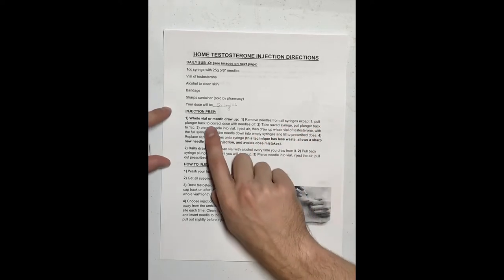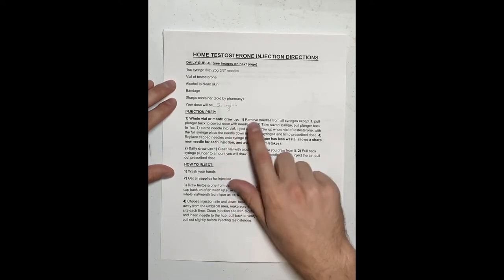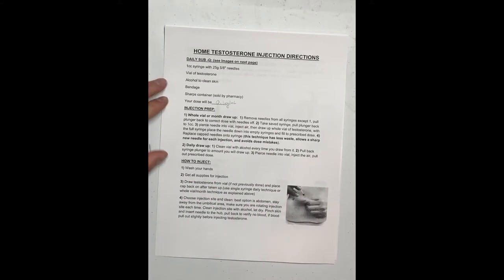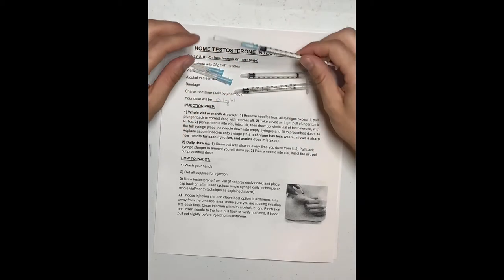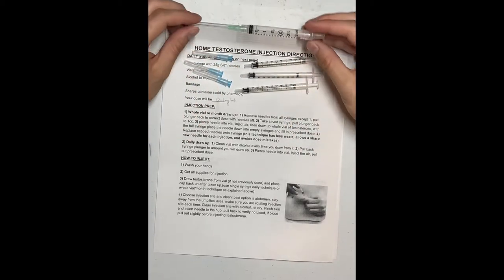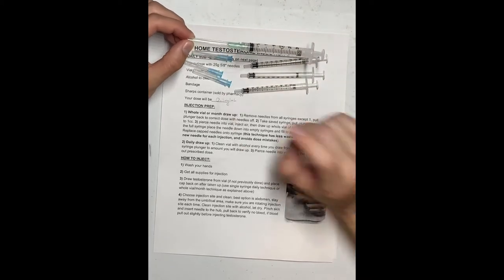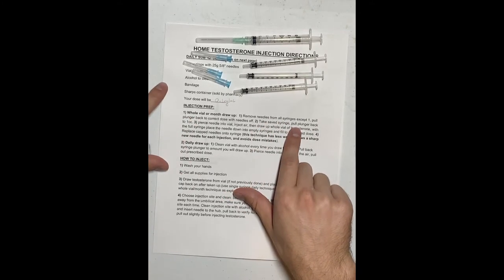Moving on to the first method — the whole vial or month draw. Step one: remove needles from all syringes except for one. I'm going to take the needles from all the syringes — you'll most likely have more than just three. This remaining syringe with the needle is my transfer needle; it's not my injection needle. It's what I'll use to fill the other syringes.